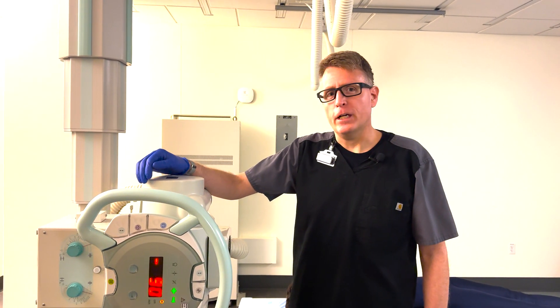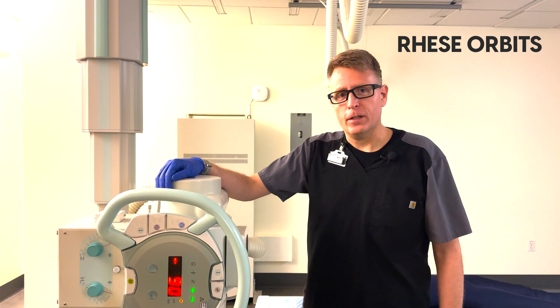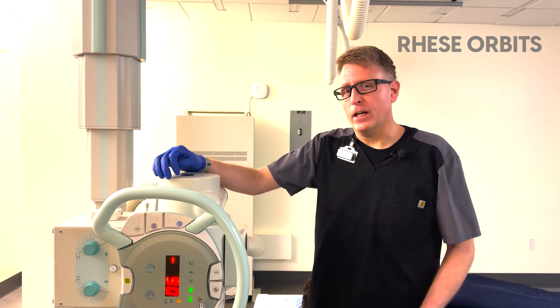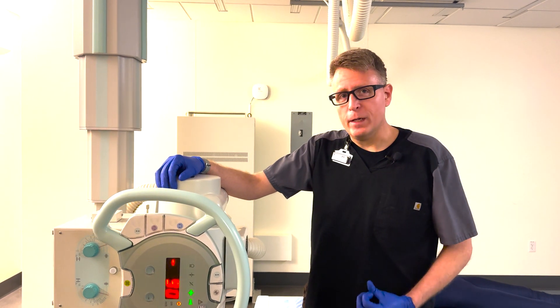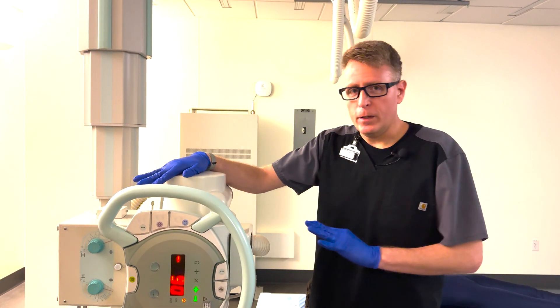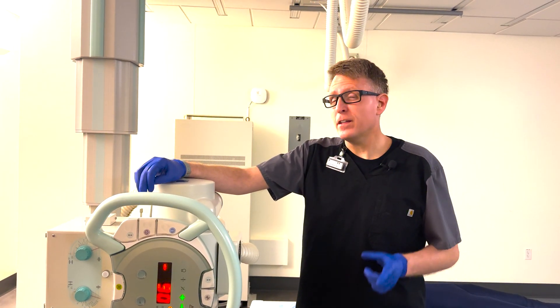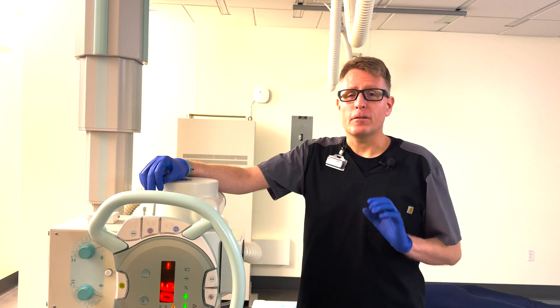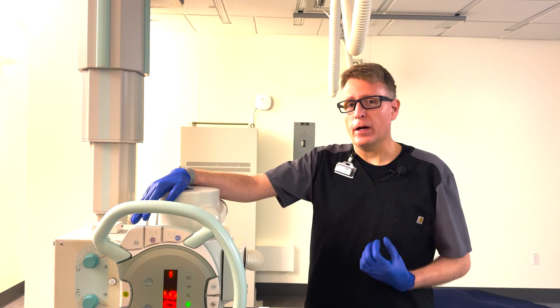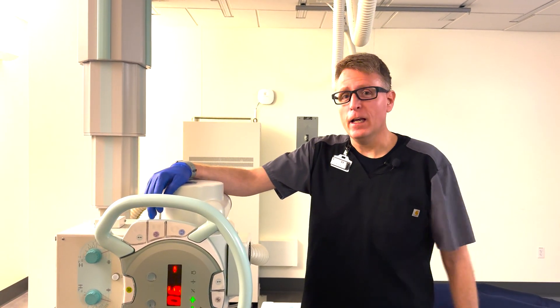We're going to show you a projection that's not even in the 15th edition of Merrill's Atlas anymore. It's the Reiss view for the orbit of the eye, and it's designed to show the optic foramen. Most of the time, if this comes into your department or your site, you're going to get really excited because they hardly ever order complete orbits, but most of the time it's the wrong order. So you've got to read the comments and make sure that what they actually need is a pre-MRI orbit screening. That's not what this is — this is to look at the optic foramen.